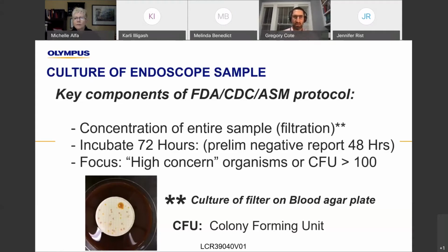Right. So this is, as Michelle said, that the technique of simply getting the sample is sophisticated. And so to ask our nurses and technicians to all be universally comfortable with this is, I think, unreasonable. So obviously, as part of your program, there needs to be individuals who are identified that are responsible for obtaining these cultures.